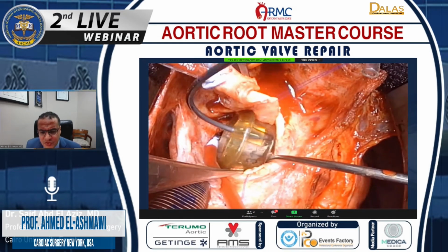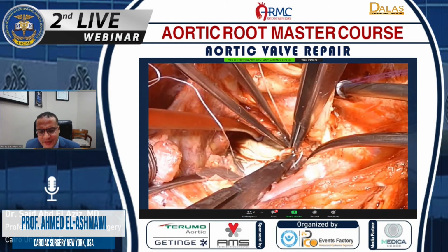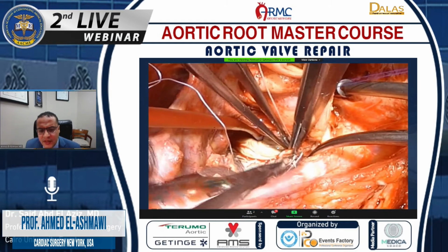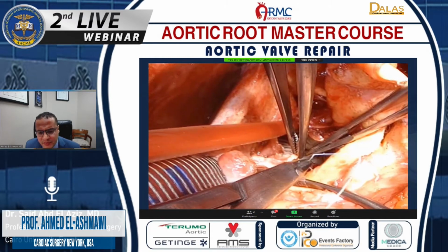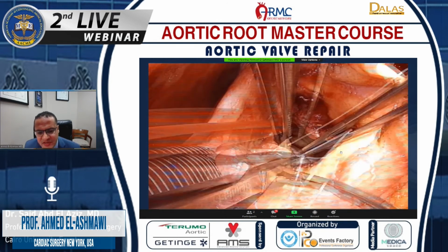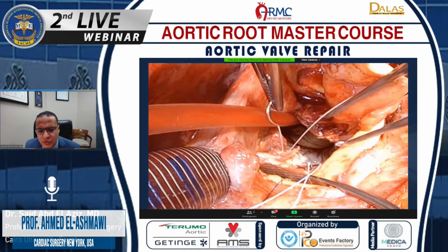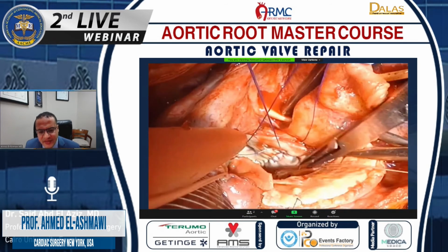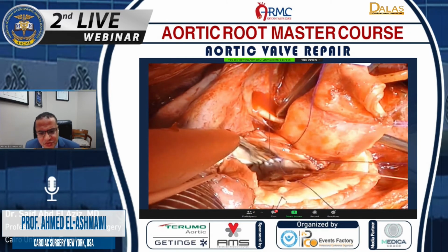We then started to put in the mitral valve replacement sutures. We started at the lateral trigone of the heart, and then we put in the medial trigonal sutures. We start with this suture because it also acts as a retraction suture, so you don't have to add a specific retraction suture to expose the posterior mitral annulus. We then close the left atrial appendage from inside, and we tie the suture outside the heart over a pledgeted suture.